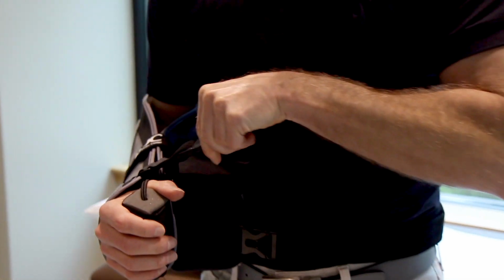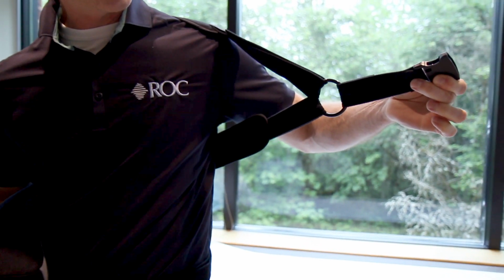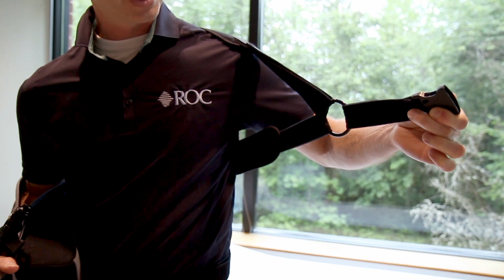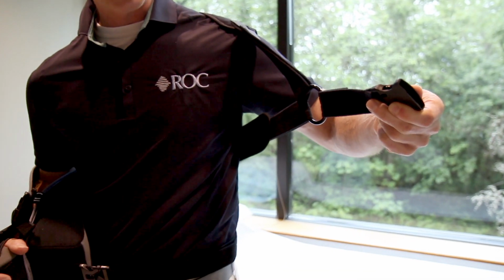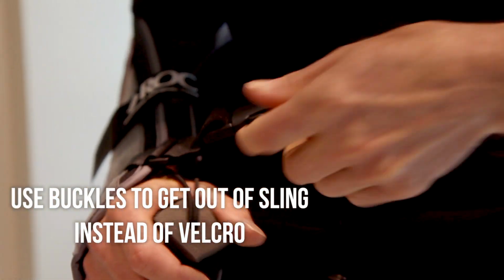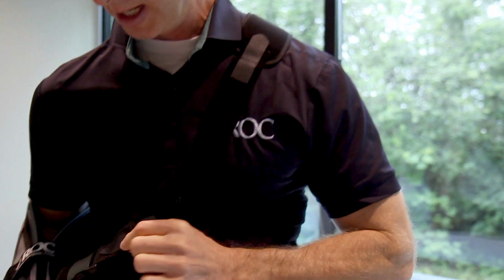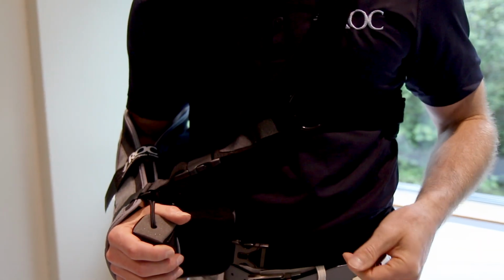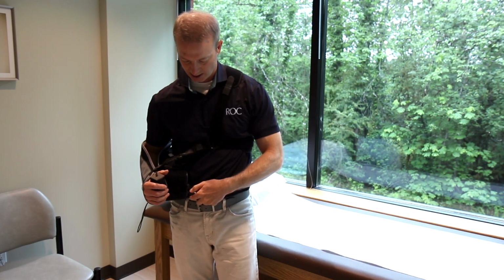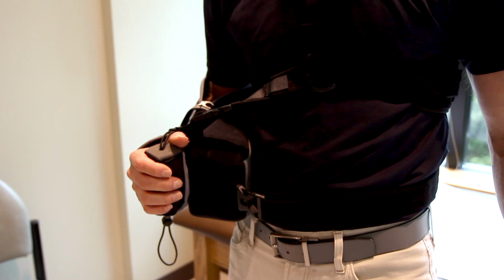There's the single shoulder strap that we discussed. You can see how there's one strap that goes under the armpit and one that goes across the top of the shoulder. I recommend that once we have the tension adjusted, that you just use the buckles to get in and out of your sling, as opposed to using the Velcro tabs here and here, because then you'll have to reset your tensioning. And then finally there's the waist strap here that comes around the waist and buckles here to help keep the pillow adjacent to your side.